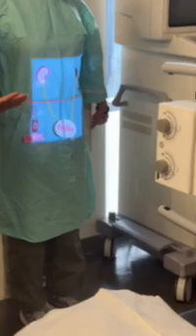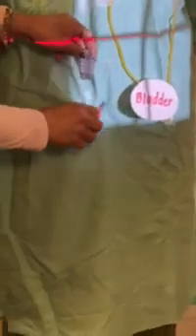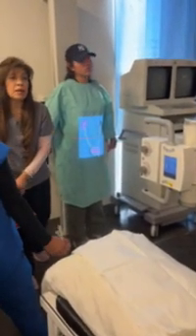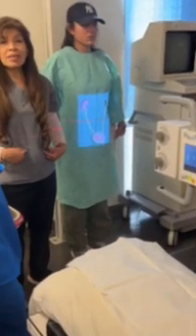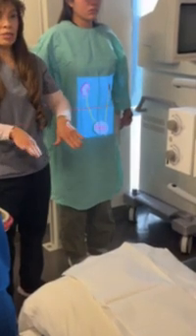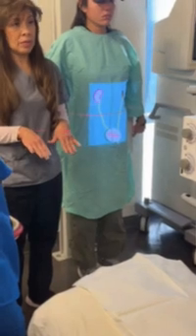Now, let's say the patient, when you were in the 15 minutes and you were looking at the obliques, okay? You were looking at the obliques and contrast was not visible in the bladder yet. One side was going through, but the other one wasn't. So there is a delay of the contrast, the pelvises of the kidneys pushing that contrast through. There's a delay. So which image should I be doing?